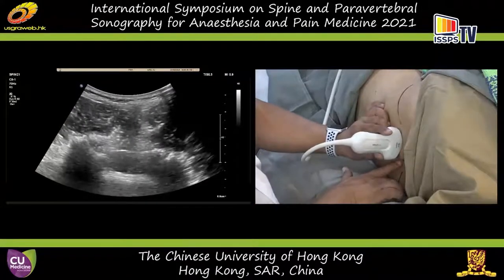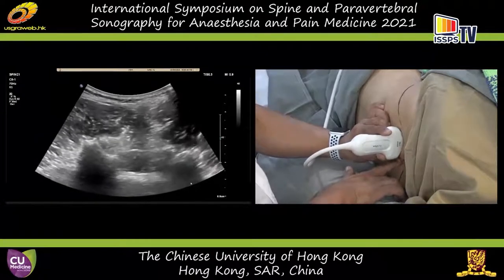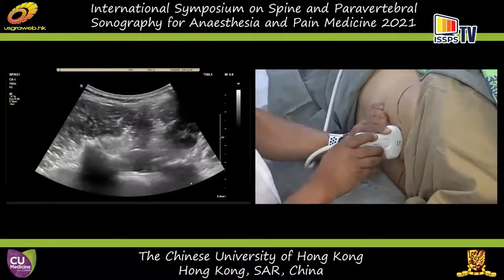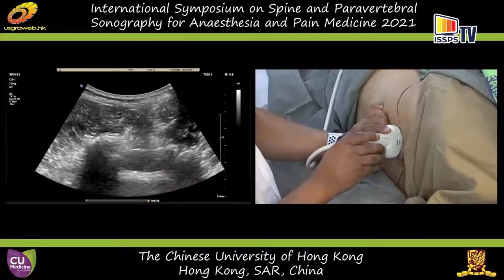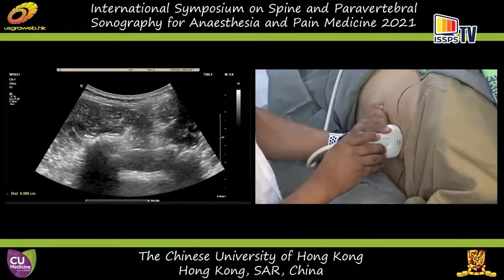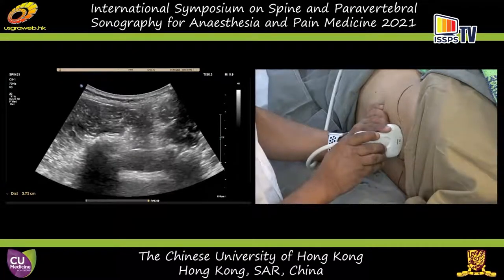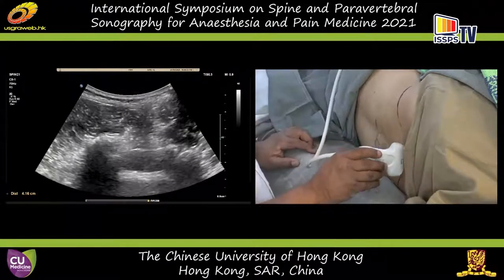We prefer to do it from the dependent side, so that your needle would emerge from here. Use an introducer needle — it acts like an aiming device — and then through that you can insert your much thinner final needle. It punctures the dura and you get your thecal sac.